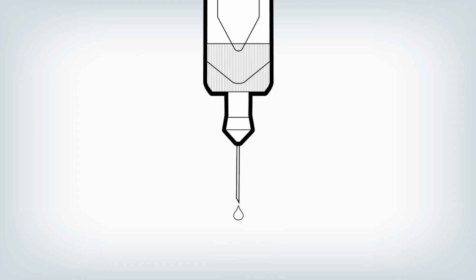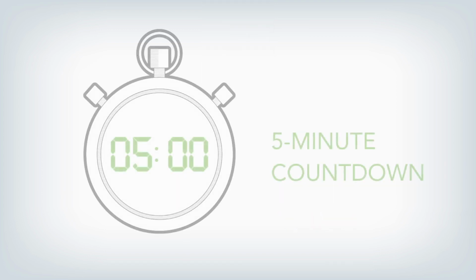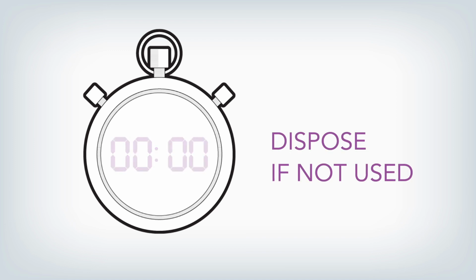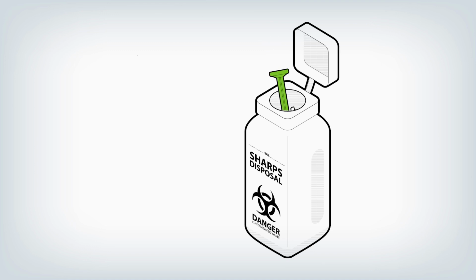You may see a drop of liquid at the end of the needle. This is normal. Do not touch the needle or let it touch any surface. Once the needle cap is removed, the injection must be started within 5 minutes, or it may be more difficult to inject as the medicine could dry out and block the needle. If the needle cap is removed for more than 5 minutes, the syringe should be disposed of in the sharps container and a new syringe should be used.